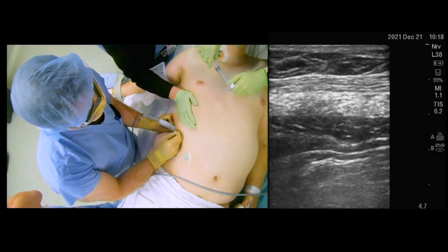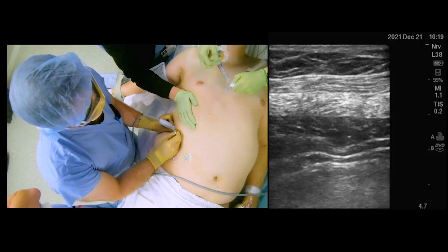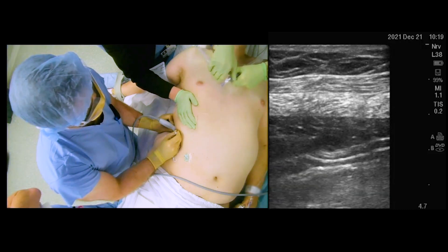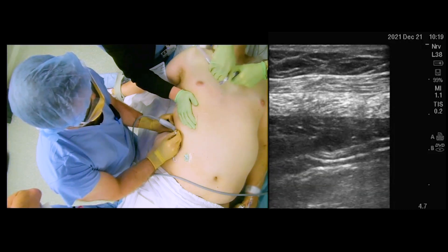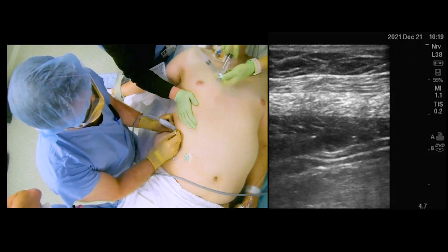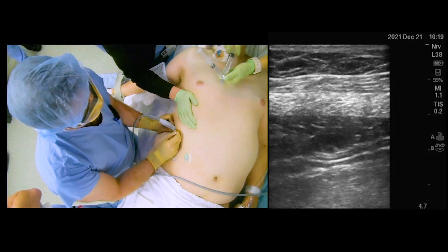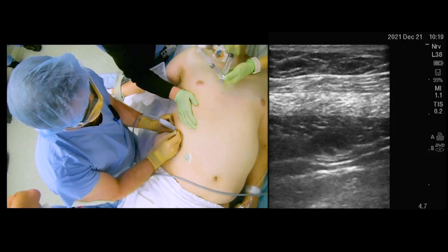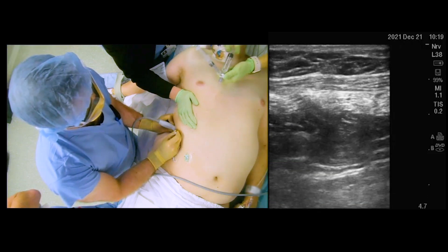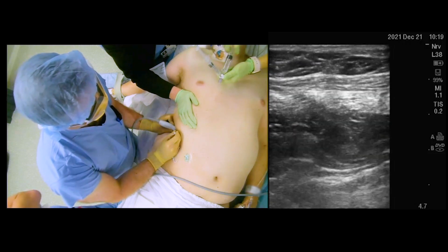The needle was advanced in an in-plane approach until the fascial plane between the internal oblique and transverse abdominis muscle was obtained. Hydrodissection was performed with normal saline. Once appropriate position was found, the local anesthetic was then administered.